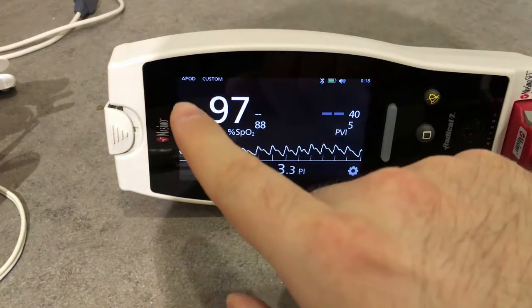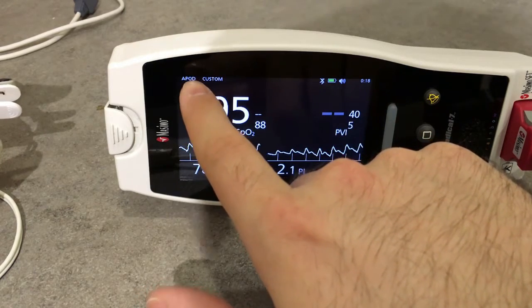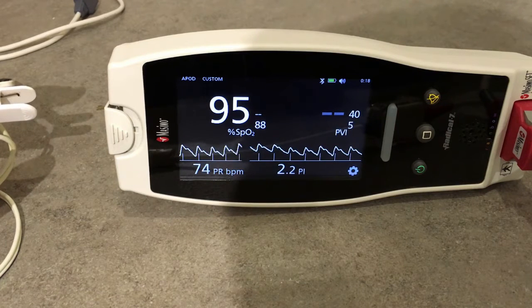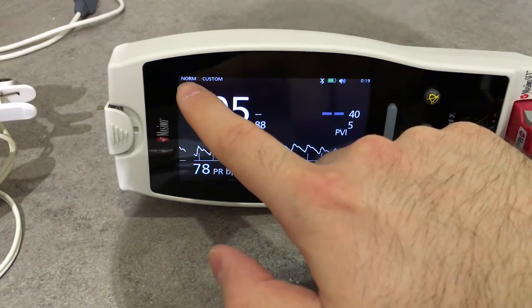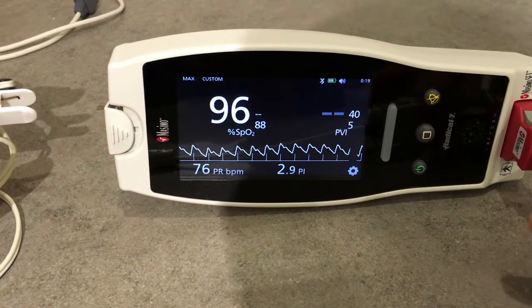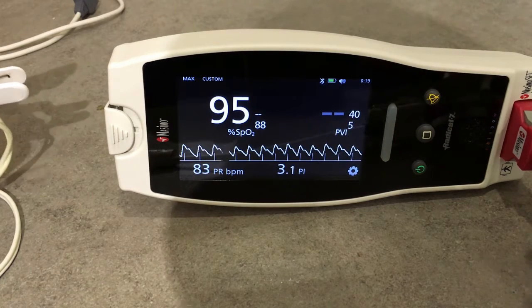On the top part of the screen we can set the sensitivity mode. We are currently in APOD — Adaptive Probe Off Detection — which is a series of algorithms that analyze the signal to determine if the sensor is off patient. This is the least sensitive mode for picking up a reading in patients with low perfusion. You can adjust this option according to the status of your patient.